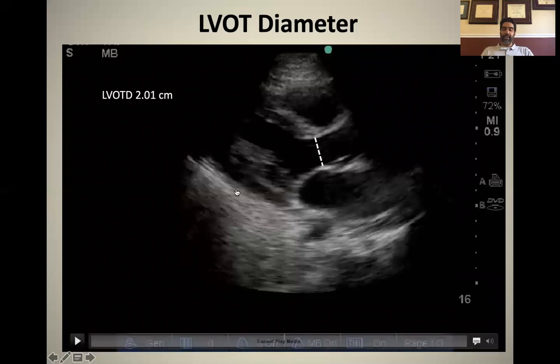You want to get the prettiest looking parasternal long axis view you can get. And specifically, you want the LVOT to be as pretty and crisp as possible, okay? So you want to optimize your angle, optimize your rotation, all those things. And sometimes zooming in on the LVOT can help as well. Sometimes it doesn't help, but sometimes it does, so you can give that a try as well. But what you do is you get your prettiest looking long axis view and you freeze it.